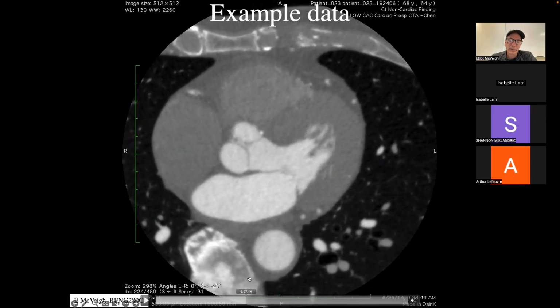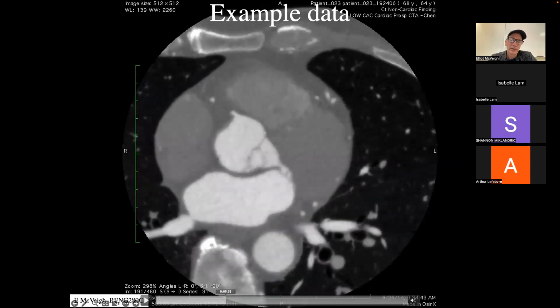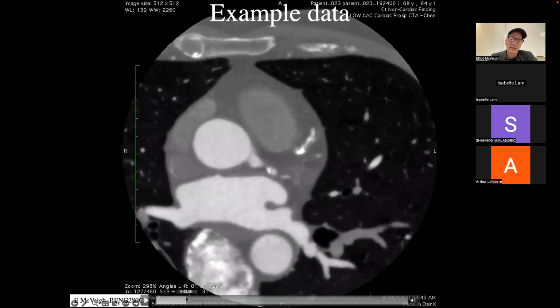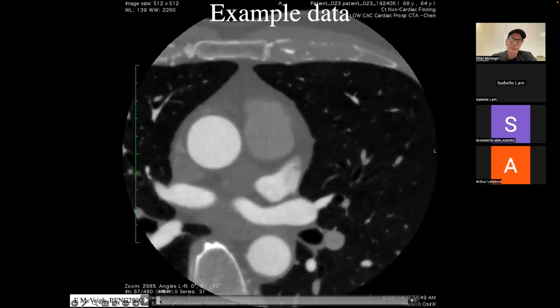Coronary arteries coming from the cusps of the aortic valve come out here. There's the right coronary, which is emanating from just above the aortic valve. And then the big left main vessel comes off here and then goes to the left anterior descending and then also wraps around here as the circumflex. So the entire heart is basically sampled.